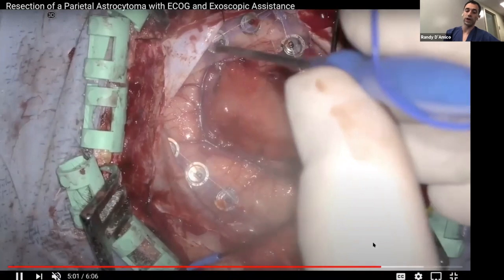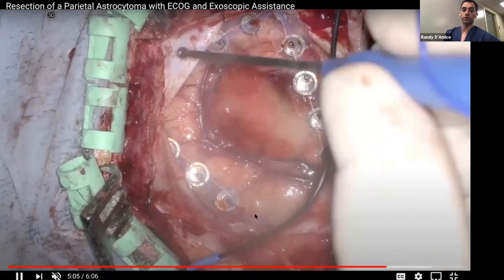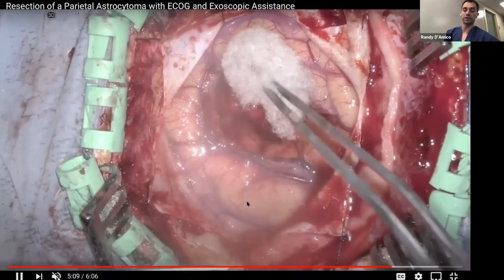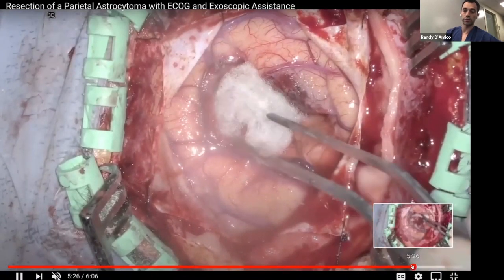Now, this is obviously not an awake surgery. Like I said, I'm going to find you guys an awake one. But this is critically important to show that the motor function here, we're able to get right up to it, but it still remains intact. This is hemostatic material. Again, they're going to start closing now, so we're pretty much done.